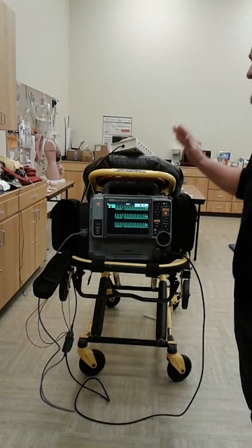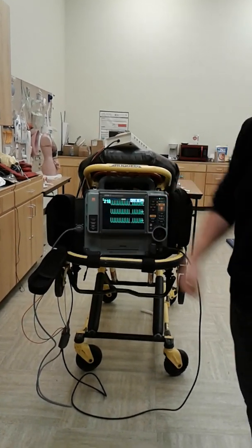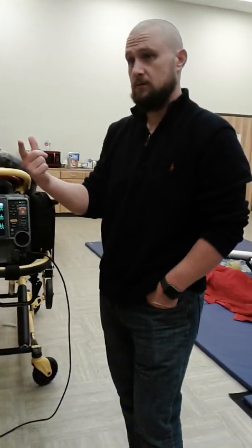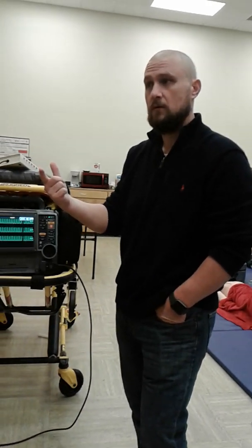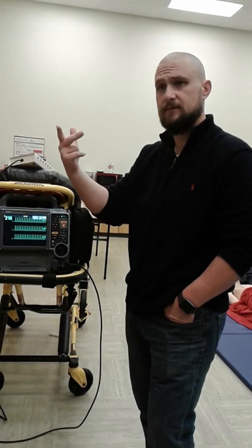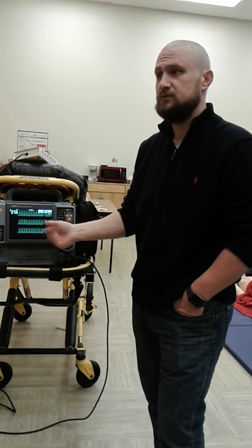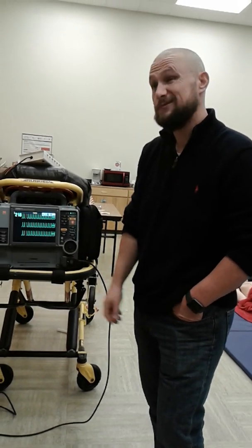So we've established this is a regular rhythm. It's got a rate of 212, 216, okay? So that is normal or abnormal? Abnormal. Step number 1 is abnormal. Step number 2 is rhythm. Is that a regular rhythm? Irregular? It's regular. Okay.